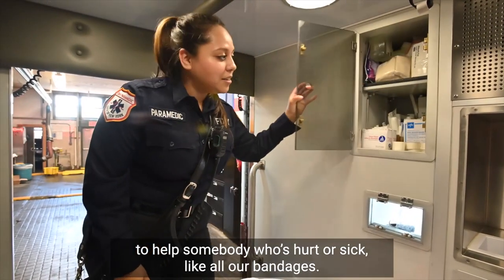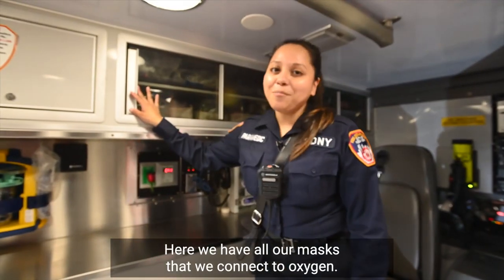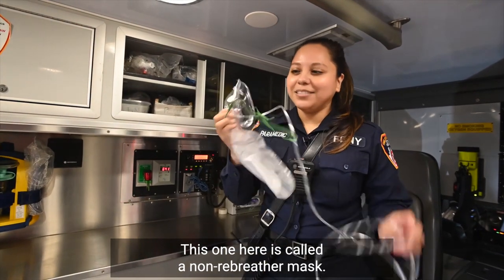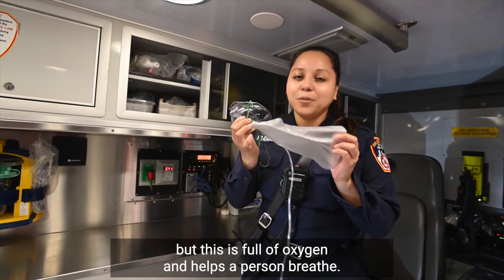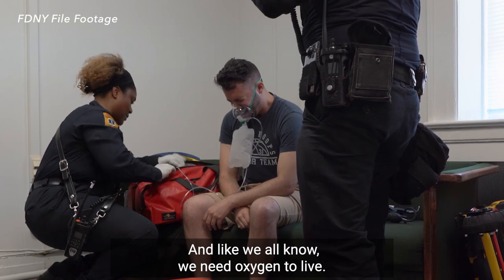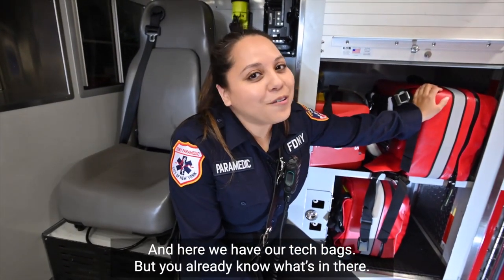Back here we have all our equipment that we need to help somebody who's hurt or sick, like all our bandages — we have different sizes depending on where you're hurt. Here we have all our masks that we connect to oxygen. This one here is called a non-rebreather mask. It may sound funny, but this is full of oxygen and helps a person breathe. And like we all know, we need oxygen to live. And here we have our tech bags, but you already know what's in there.